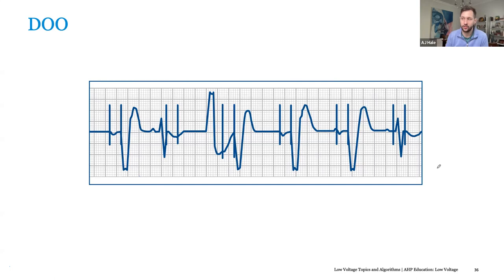I think that having just one electrode in the atrium is not ideal. If down the road they created one that had a ventricular electrode and a couple of different atrial electrodes, kind of like what we see with an IS4, that'd be nice. But honestly, we're seeing leaded devices going by the wayside within the next decade or two. I think there's still going to be a future for them, but companies are investing more in leadless technology, so we're going to see less innovation. I could be wrong, don't get me wrong. I don't know what all the other companies are doing, but it does have its advantages.